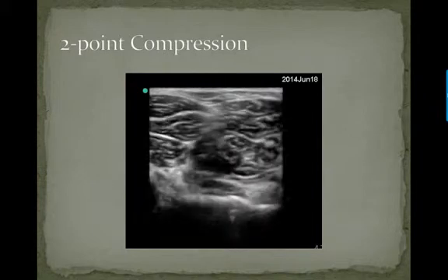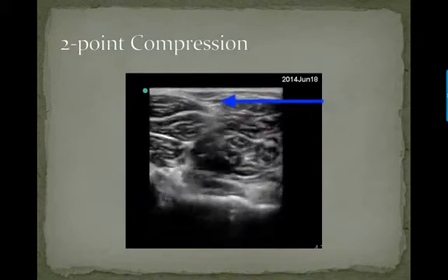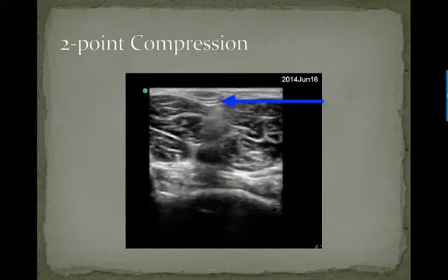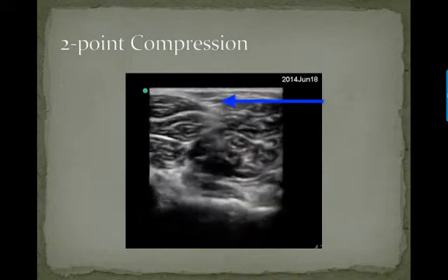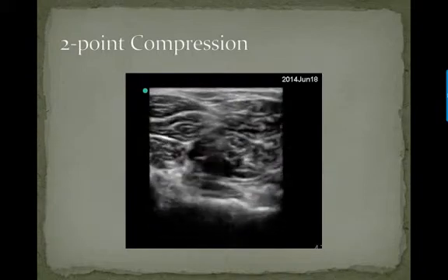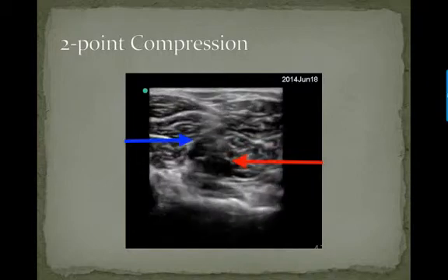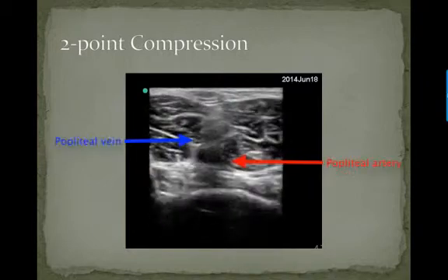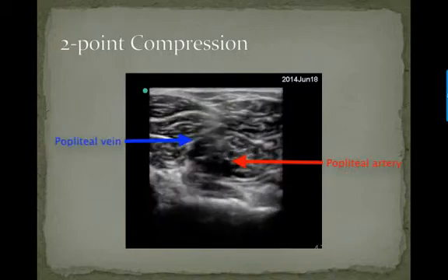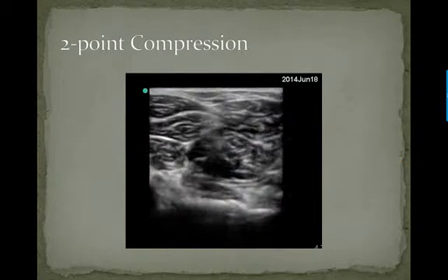However, the superficial veins do not run next to arteries, so that's a good clue that you're looking at the right vessels if you see an artery. In this example, we can see the popliteal vein sitting on top of the popliteal artery, and it is completely compressing.